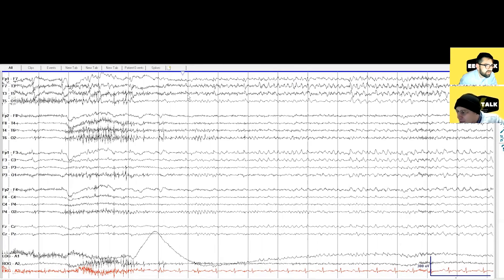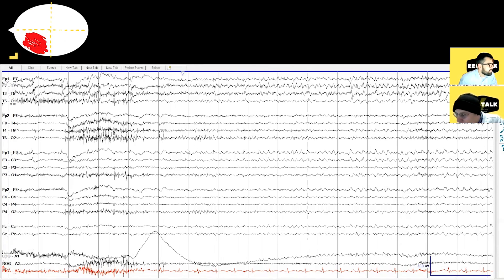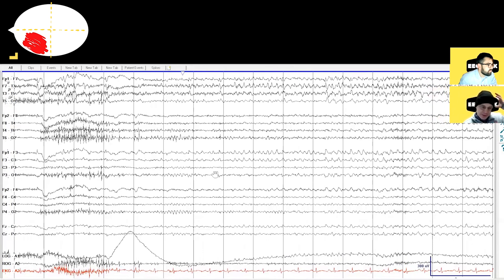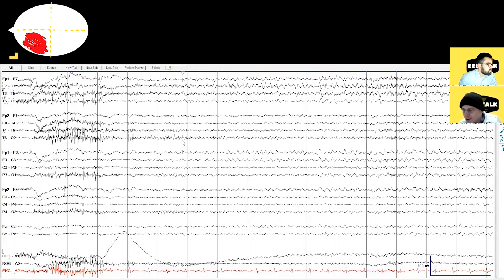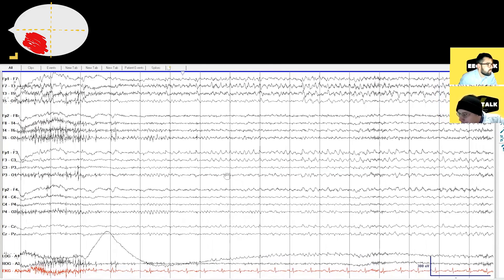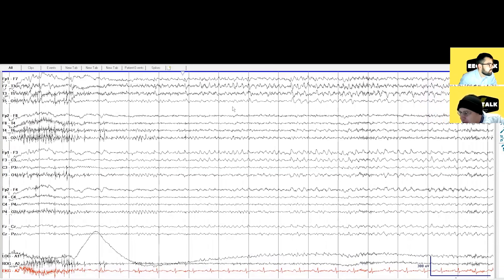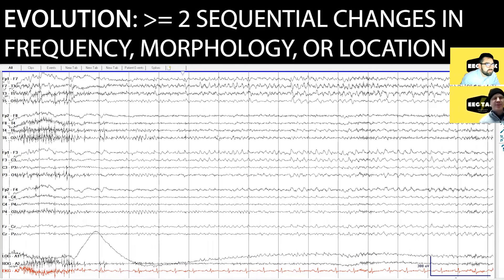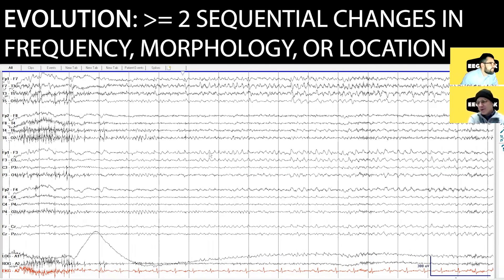Where would you locate this? I think it's left temporal. I can switch to average to make sure, but it looks at least left-sided. Left, and it's somewhere in the anterior quadrant if we crudely divide the head into four — so not coming from the occipital region. Okay, and it kind of evolves, doesn't it? It does. What do you mean by evolves? There's a systematic change.